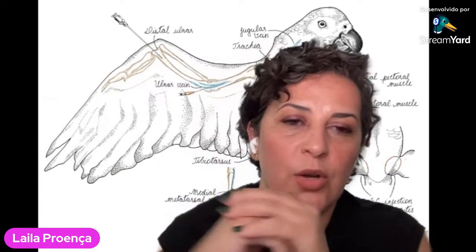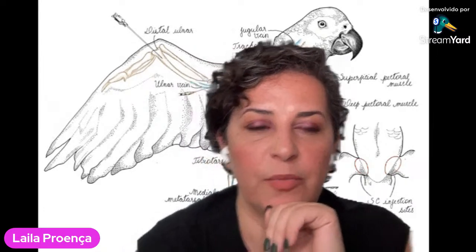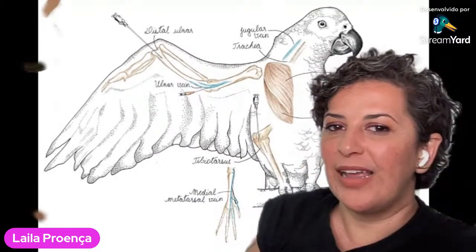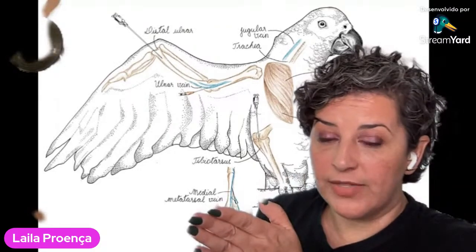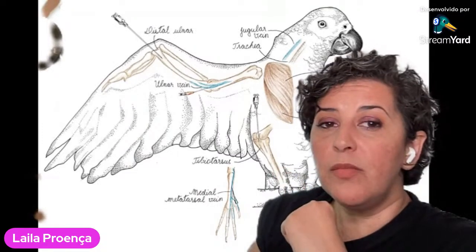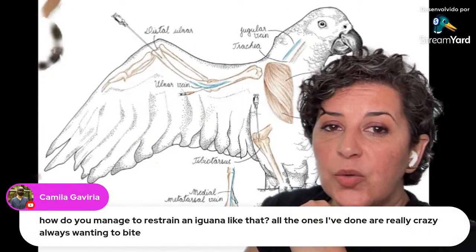Let's talk about birds. And for birds here, it depends how much blood you need to collect, and also if your patient is awake or not awake. Okay. The first place, the one I really recommend you all use, is the jugular vein. One thing to know is that the jugular vein of birds, and we're talking more about parrots here, the right side is usually larger than the left side. That doesn't mean that you can't collect from the left side. You can definitely collect from the left side. But usually the right side, the vein is a little larger. And I like to do it better.